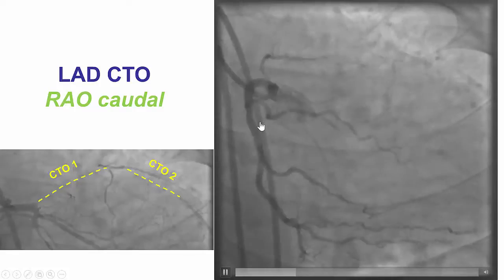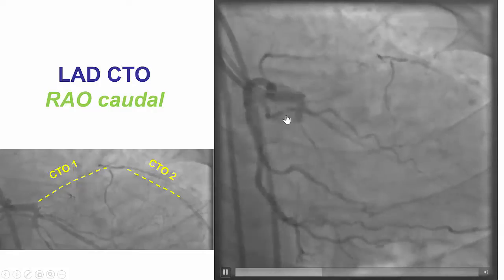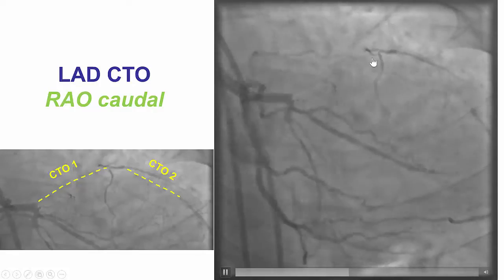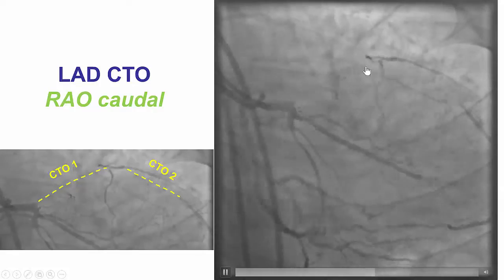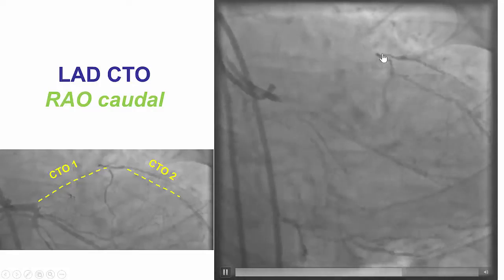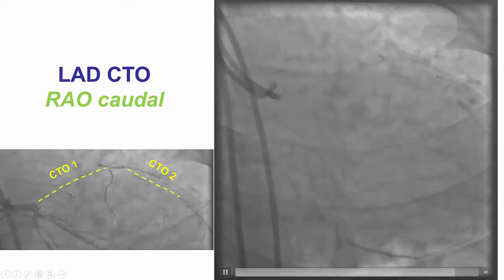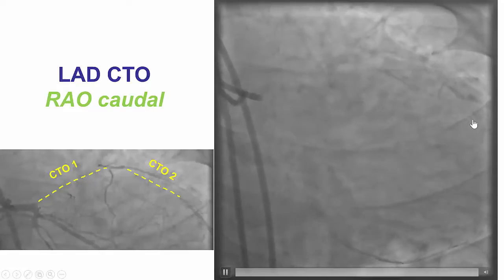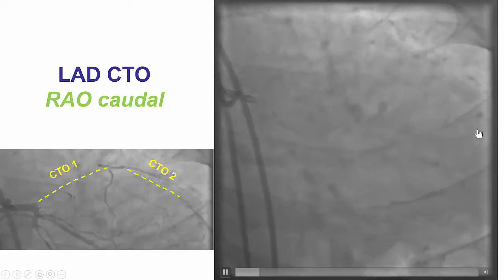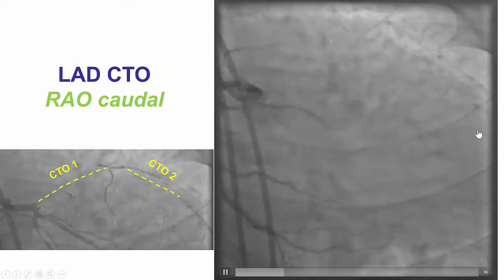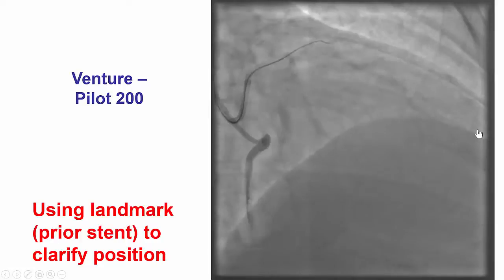This is the RAO caudal view demonstrating the previously placed stent, some reconstitution of the mid-LAD via collaterals, and reconstitution of the distal LAD via epicardial collaterals as well.